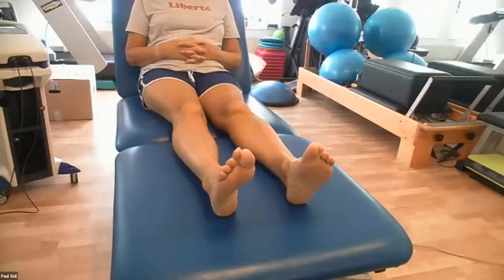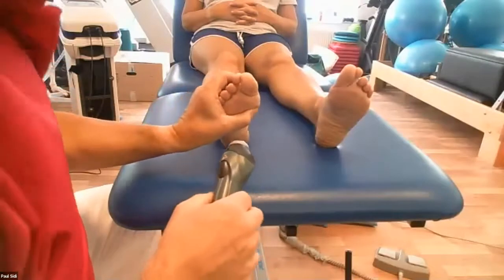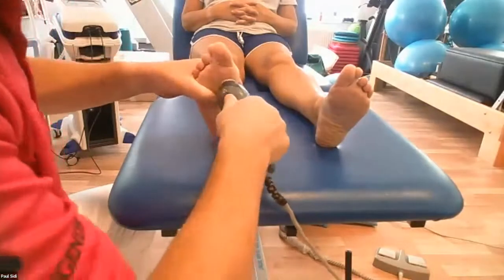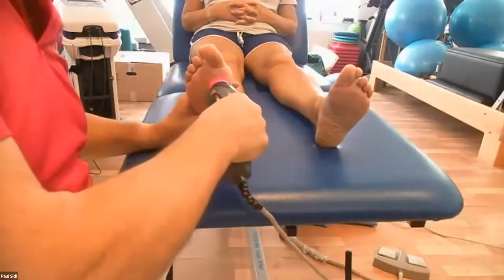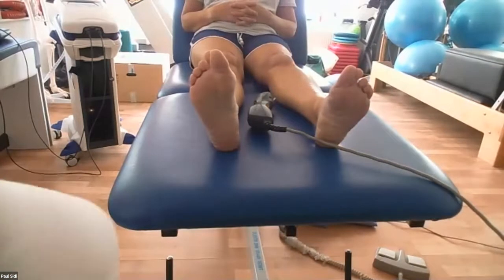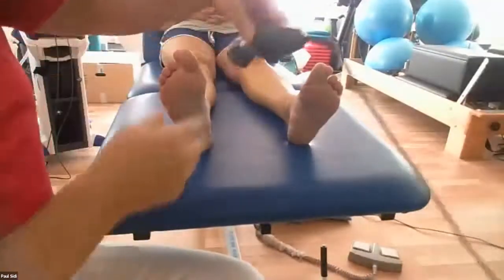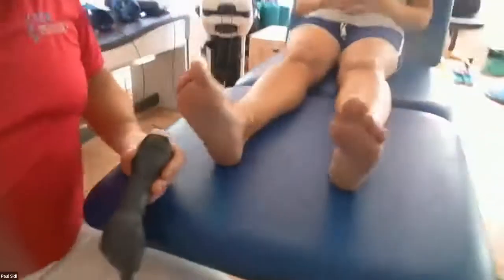Right, so 5 points we know, and we're saying, right, really sore in here, yeah? Yes. So I'm going to come right around this area here, okay? Now, I've got this on there, and if I switch the lights up, you'll see it a bit better. The very first time we're doing this, because she's in so much pain, we can probably keep the foot still.